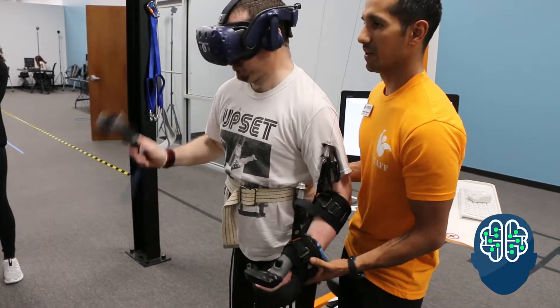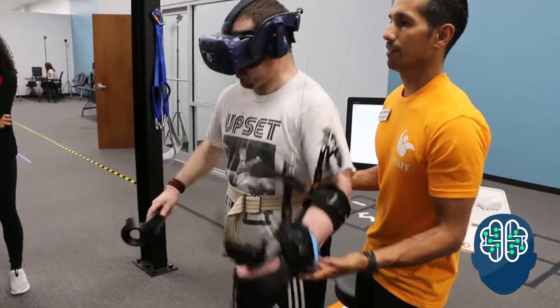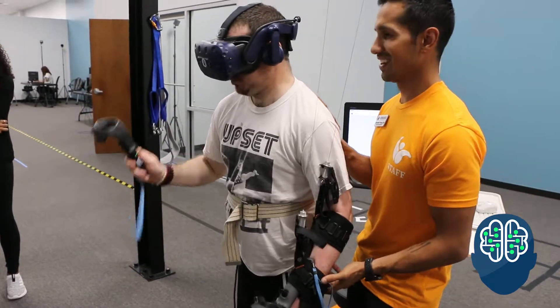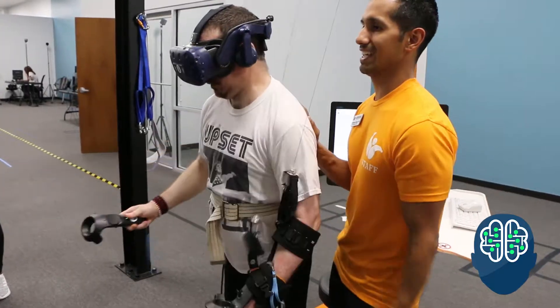We had to modify it a little on that arm because he doesn't have enough wrist function movement right now, but he's getting a lot more shoulder. Show off for the camera, Matt. There you go — big arm movement. Nice.